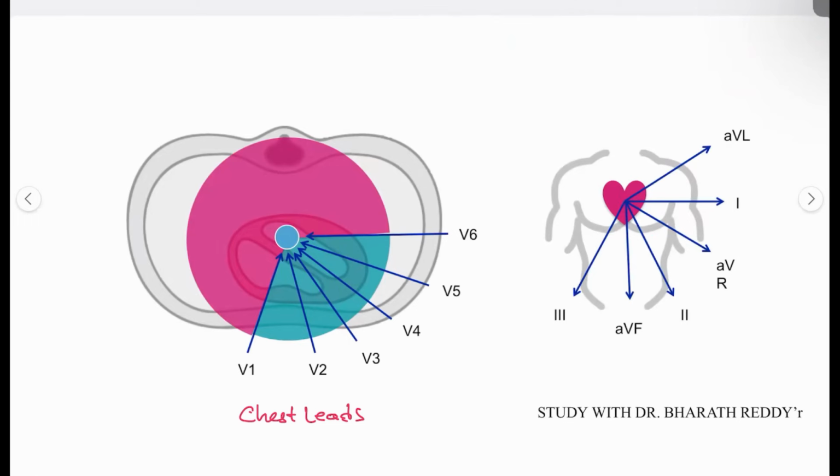And after that, when we mix the Einthoven triangle and the Goldberger triangle together, here you can see lead 1 and lead 3, which conclude your lead 2, and the Goldberger leads, AVL, AVF, and AVR. So we are just picturing the camera placed around the entire heart, and we are looking for where the electrical activity is and how it is generated in the heart.